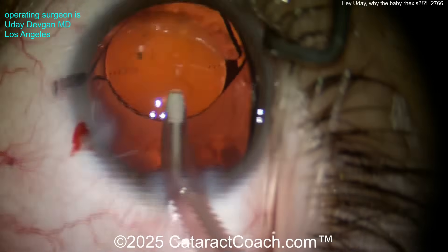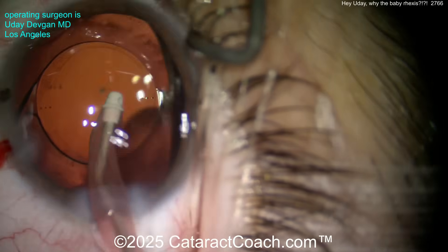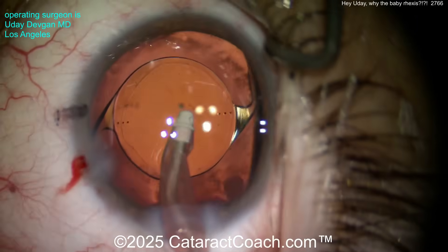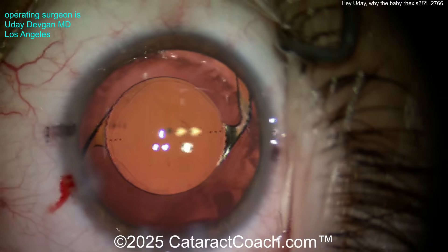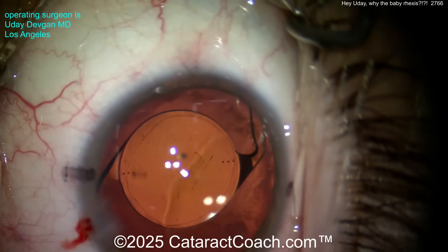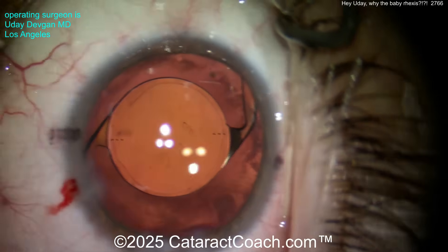I think our advanced surgeons are watching at 2x speed. But if you've done fewer than a thousand cases, you should definitely be watching at normal speed. Now look — there's the rhexis. Bam — 5.5 rhexis overlapping the optic 360 degrees all around, with beautiful centration.